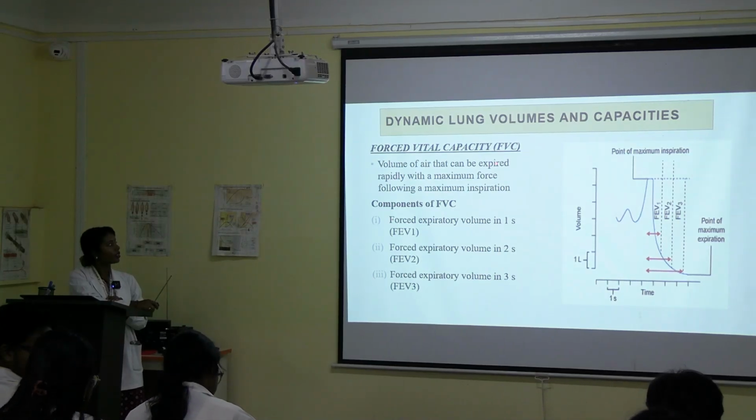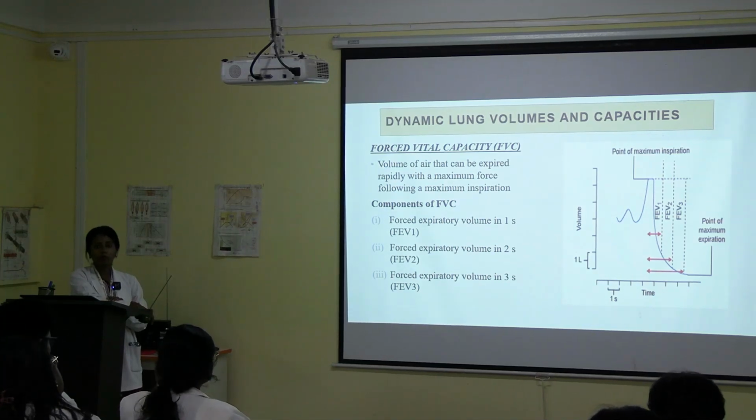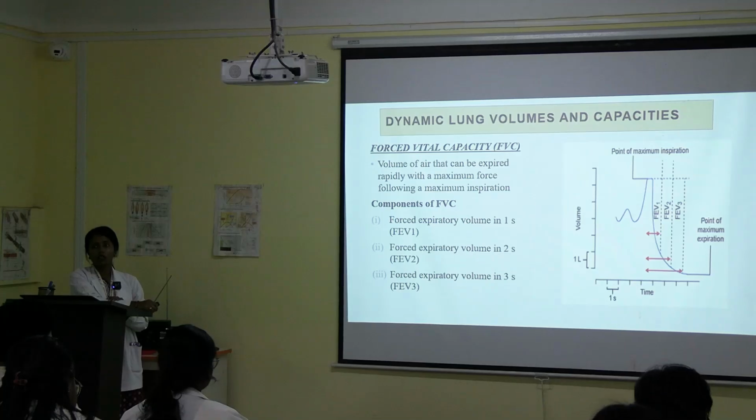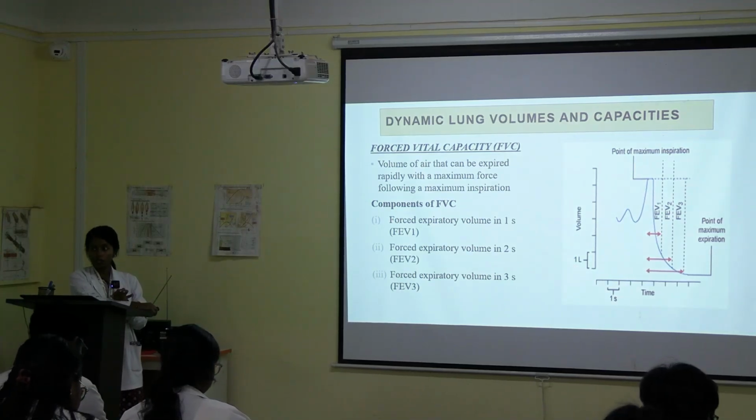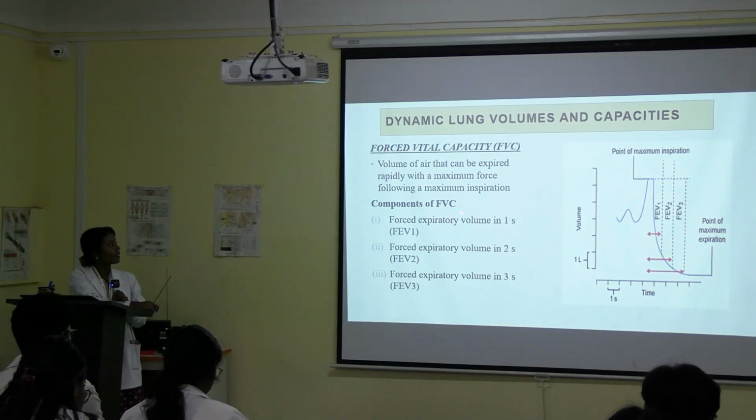After you take the maximum inspiration, the air has to be breathed out rapidly, with maximum force.